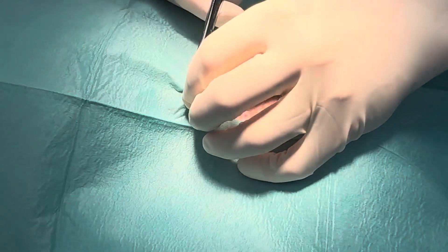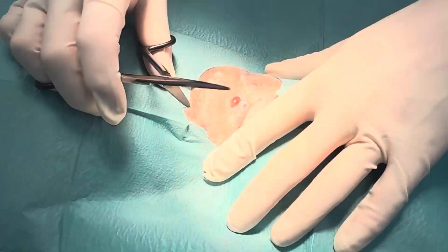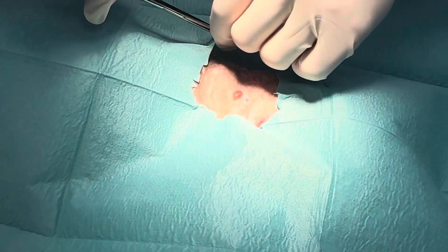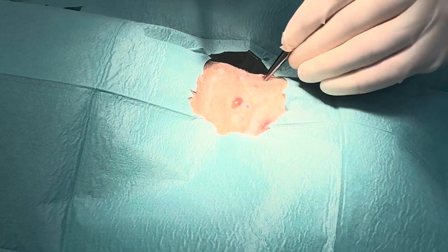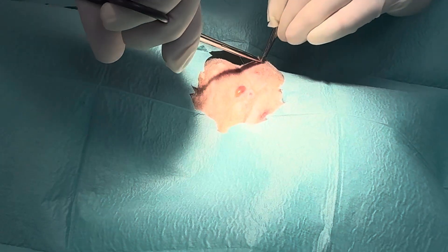The plan today is a Penrose drain, leave it in for around two to three days, flush this out a little bit, and hopefully she'll be on her way and should be absolutely fine. We've clipped the area quite generously. We're going to cut this drape to size. We've got some flush with us and we're just going to make the puncture wounds a little bit cleaner. What you want to do is debride some of the wound just around the outside of where the skin was penetrated.